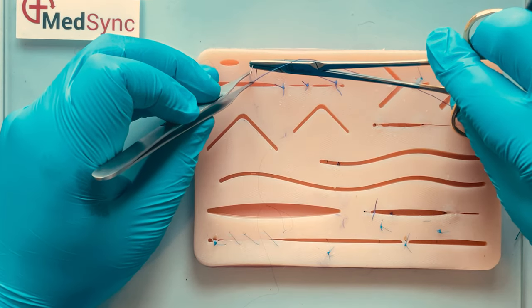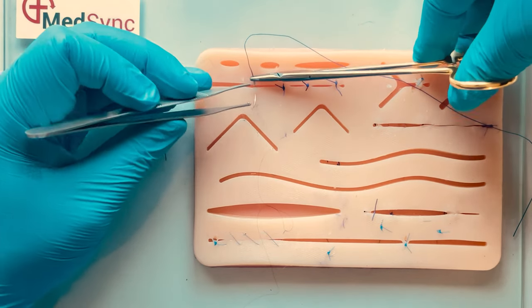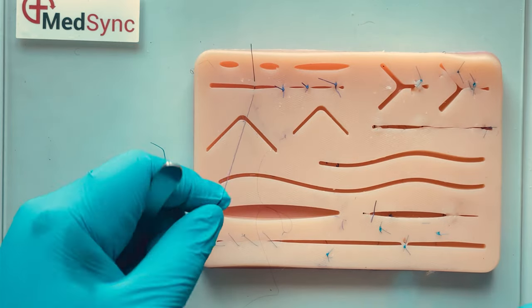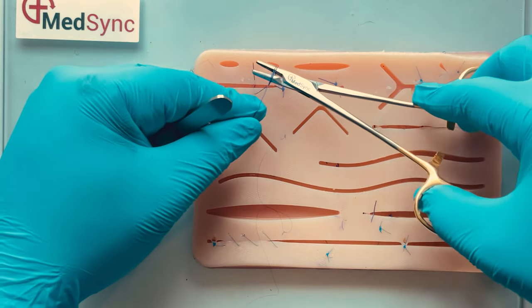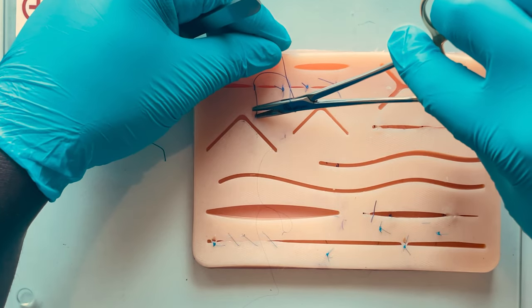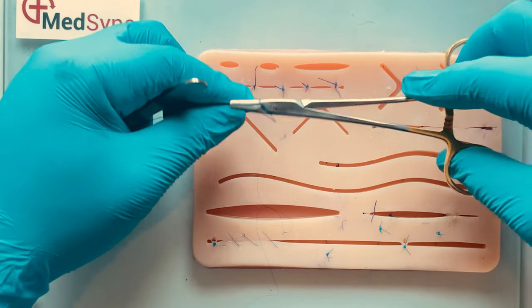When you tie a knot keep the short end around two centimeters long and hold the long end reasonably close to the wound bed. Wrap the suture around the tips of the needle holder and retrieve the short suture by its tip. This prevents getting caught in knots.